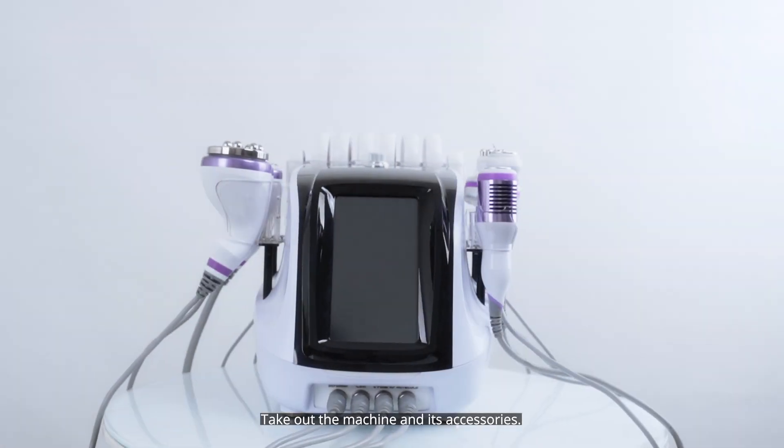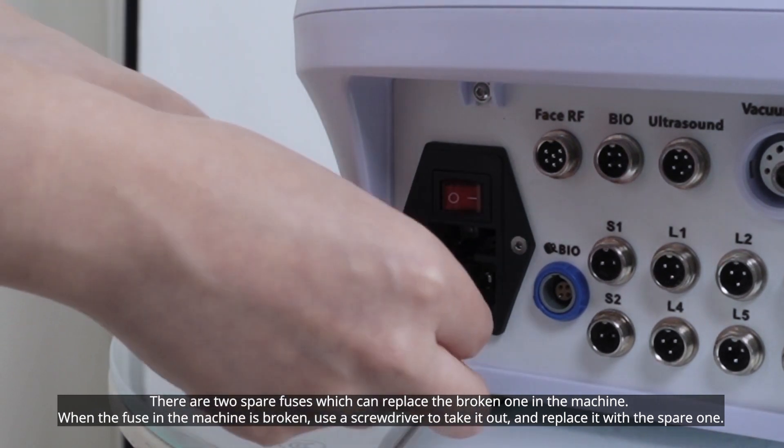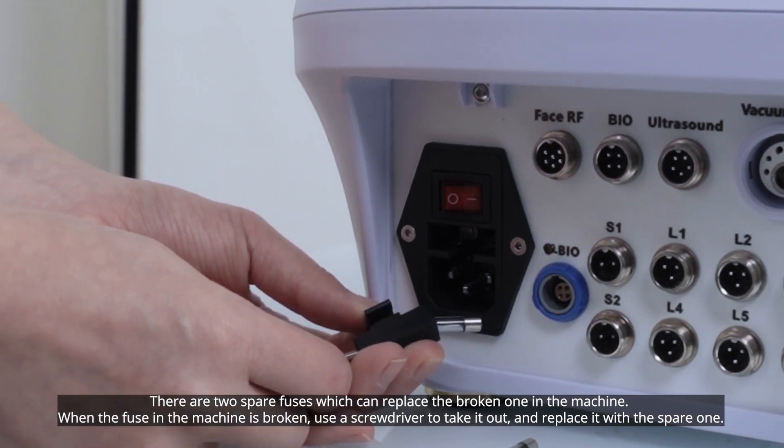Take out the machine and its accessories. There are two spare fuses which can replace the broken one in the machine. When the fuse in the machine is broken, use a screwdriver to take it out and replace it with a spare one.